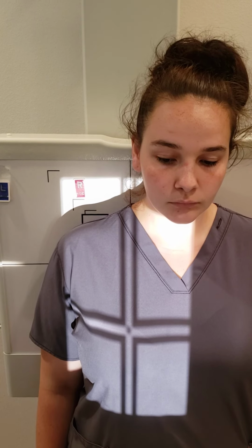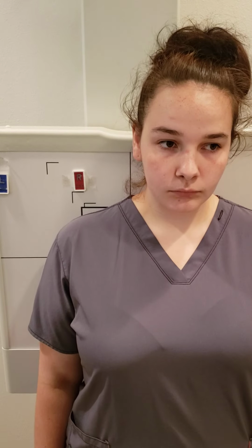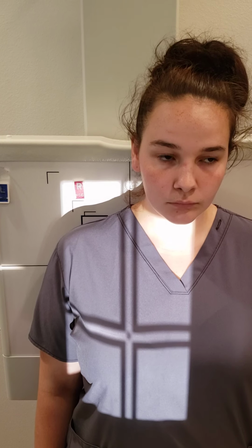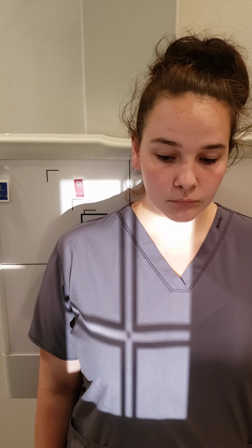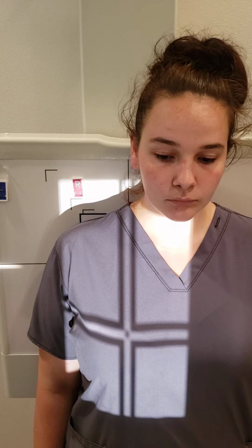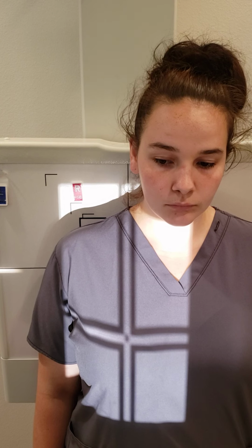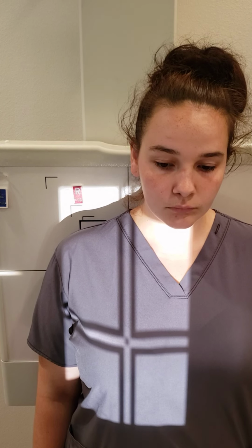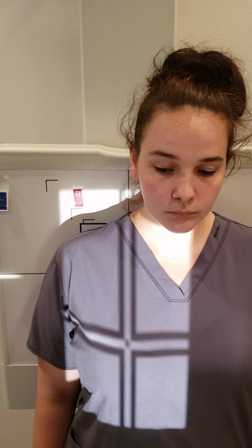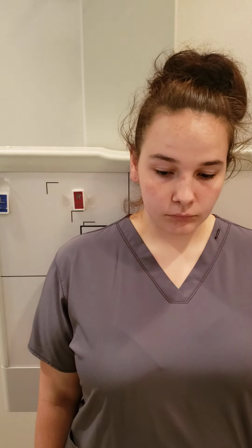And on this one, if we're looking at the upper ribs, we'll do the respiration on inspiration. And if we're looking at lower ribs, we'll do respiration on expiration. So for purposes of this demonstration, we'll be looking at upper ribs. Of course, you would probably have a BB marker on the area of interest. But for the AP unilateral ribs, focusing on the upper ribs, we'll do this on a full inspiration.